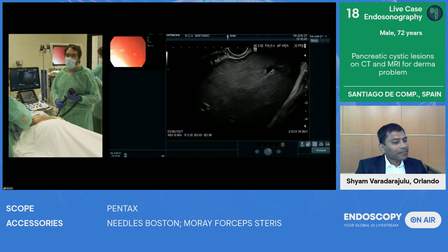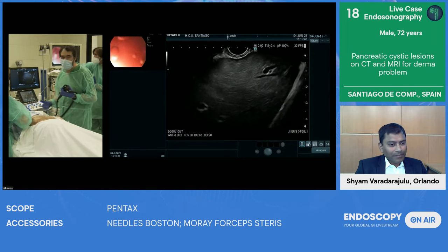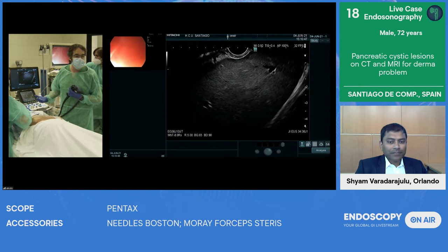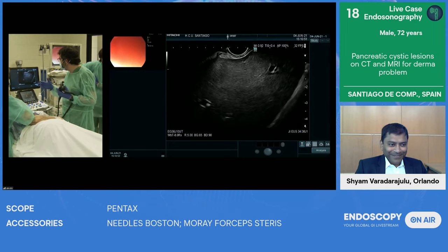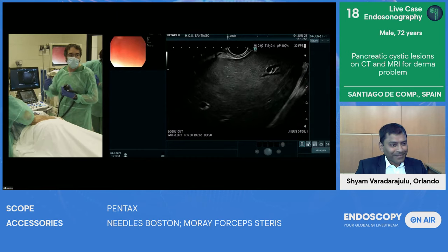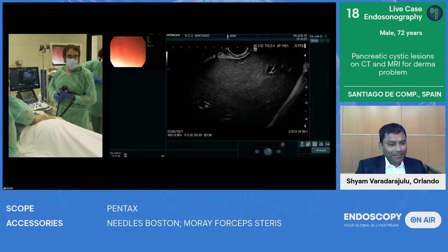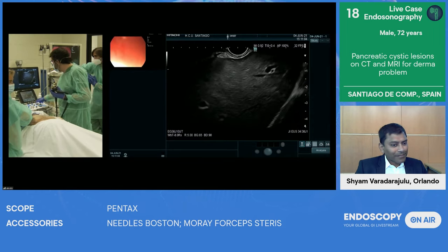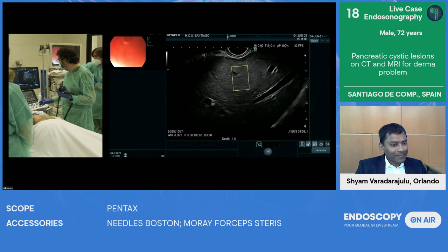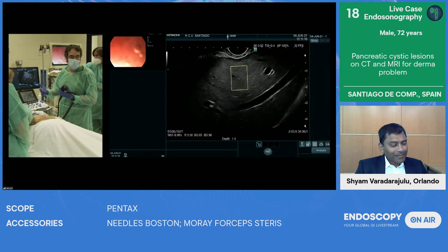We are working with the Arietta 850 and the Pentax scopes. And now we have a new technique. You know, I'm a big elastography fan, Shyam. And now we have shear wave elastography available. I want to show you, though this is at the beginning under EUS, this is a technique for the future, probably, for the evaluation of, for instance, liver disease. We need to check whether it's useful or not in pancreatic diseases. But this is how a shear wave behaves. It's like the other shear wave techniques, but EUS guided.